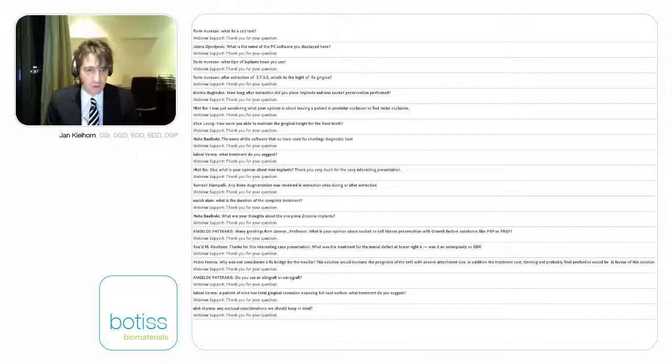Asking a question, Jose Emilio Torres. Buenas noches. Which are the most frequent complications you had with the procedure? Well, if you have good primary stability, you will not have a problem as long as you round the edges and you have no sharp things coming through the bone.